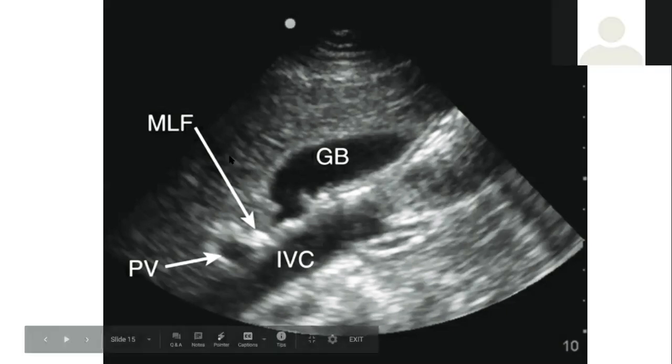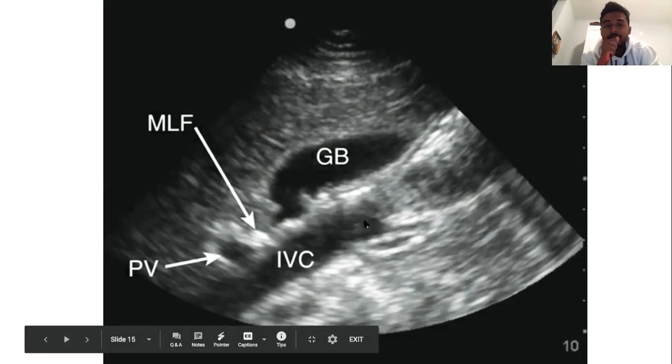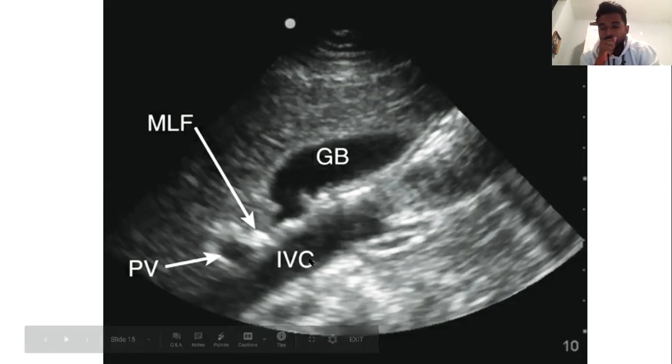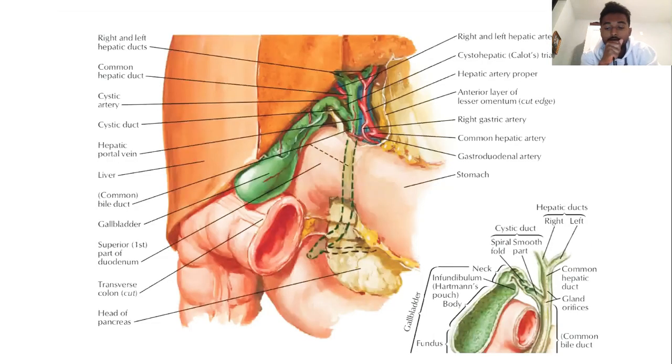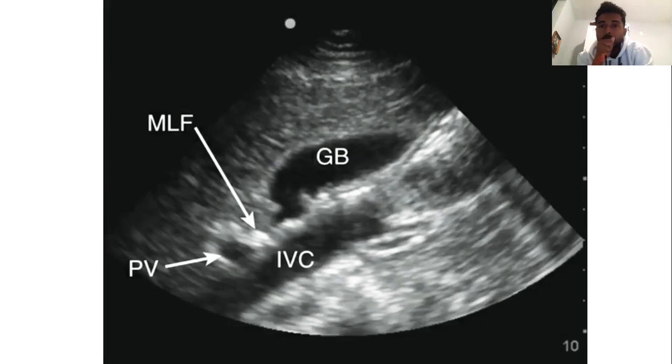You'll see a gallbladder and a liver, and you'll see a kidney right here, and you're like, well, the kidney's not that close. But that's because as it tries to get signal from the deeper end of the anatomy, it loses resolution, and when it loses resolution, it's hard for it to delineate where the actual landmark is.